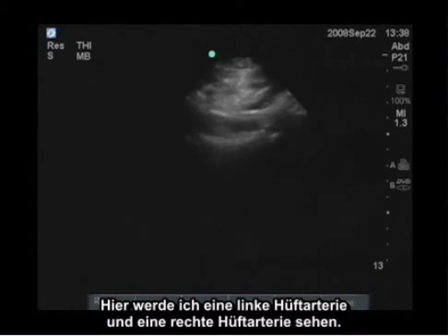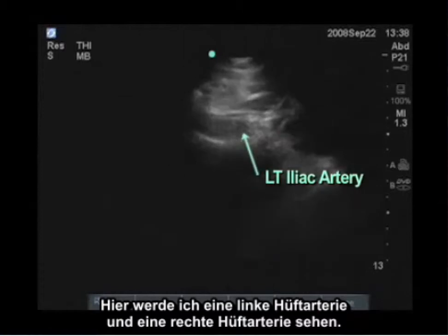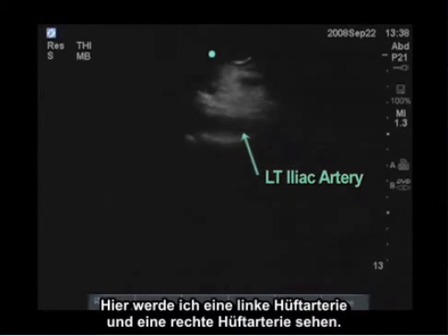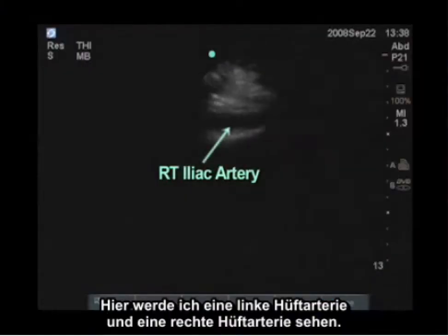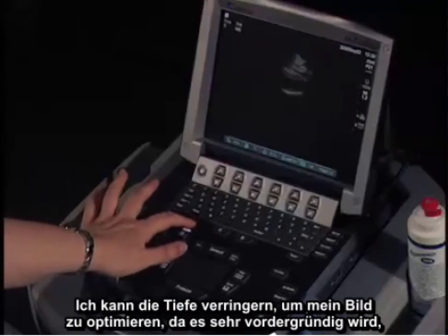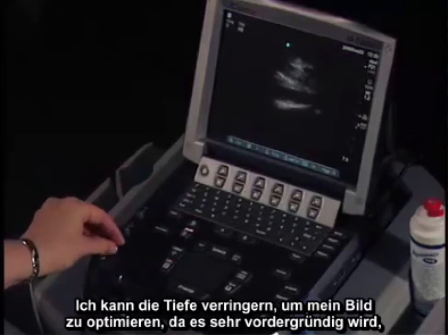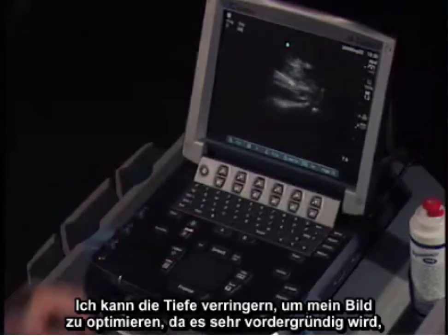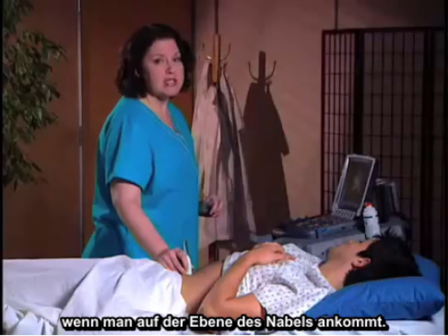I will see the left iliac artery and the right iliac artery. I can decrease the depth to optimize my image, because the aorta is so anterior by the time you get to the level of the umbilicus.